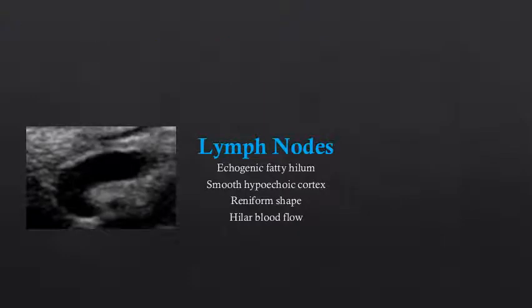Let's start by looking at lymph nodes. Lymph nodes should have an echogenic fatty hilum and a smooth hypoechoic cortex. They are often described as reniform in shape, meaning they look a lot like a kidney or a bean, and they often have hilar blood flow, which you can detect coming into the lymph node at the echogenic fatty hilum.